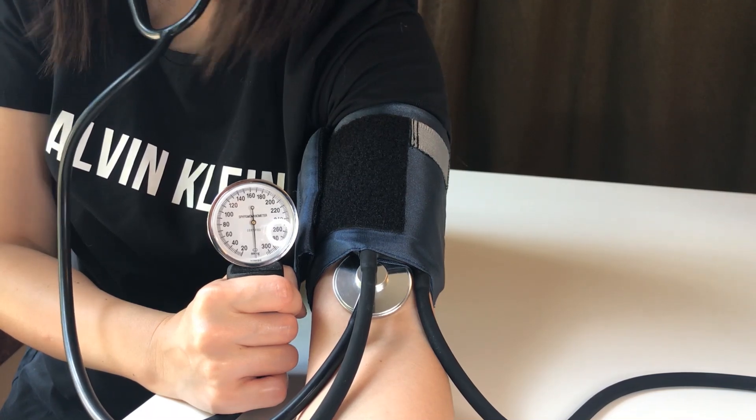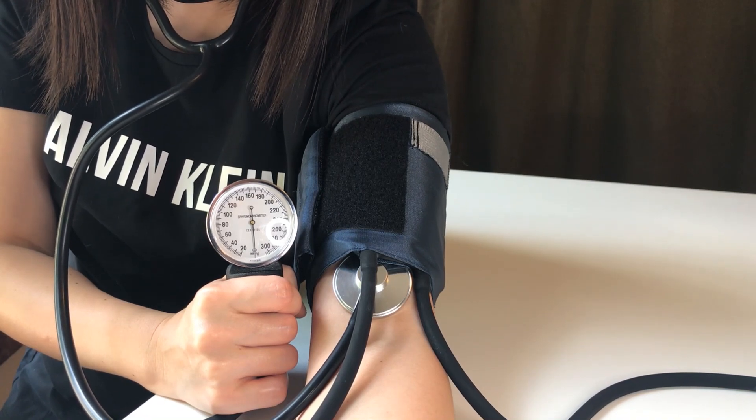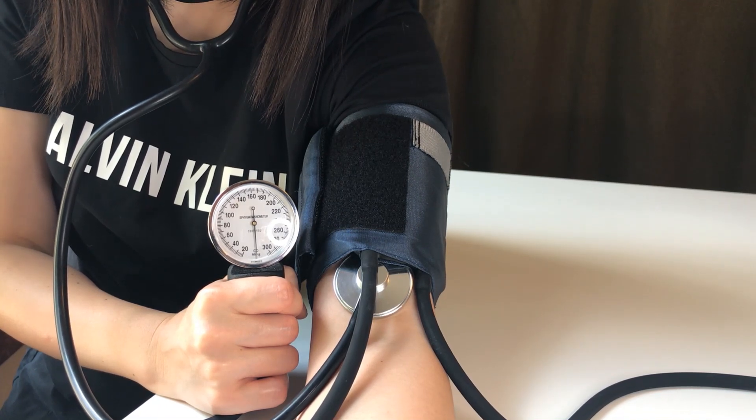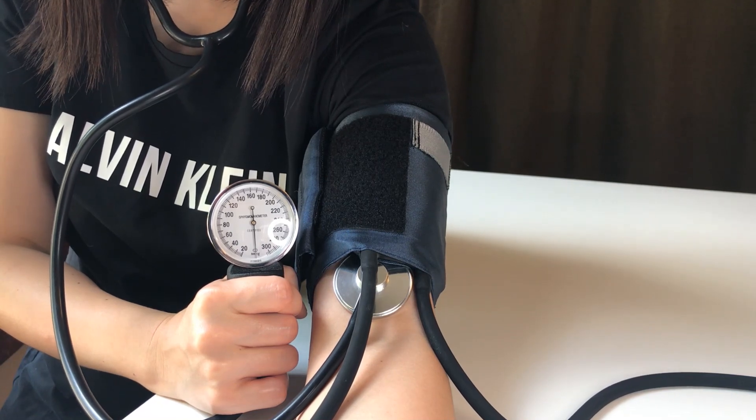When it got down to about 70 or 72, the needle smoothed out and she stopped hearing the thumping noise — that's the diastolic estimate. The diastolic pressure represents the arterial pressure at diastole, when the ventricles are relaxed. So that's why they do that to you at the doctor's office — they torture you to determine how healthy your heart is by measuring the pressure.